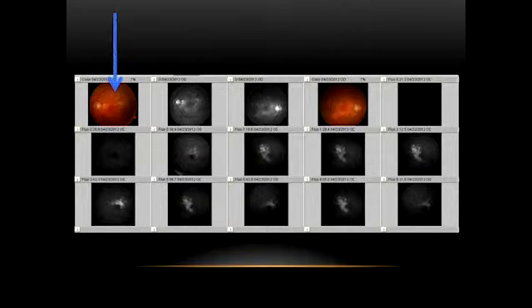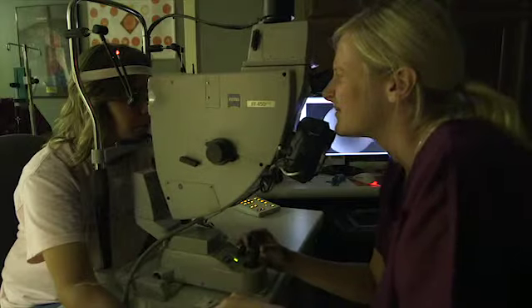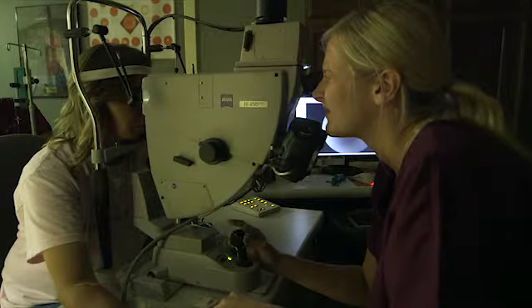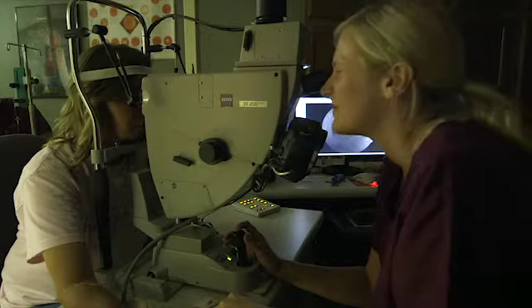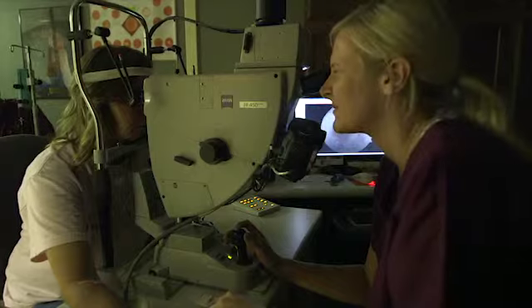Well, part of every fluorescein study is basic color fundus photography. Now, I should mention that fundus simply refers to the back of the eye. Trending macular changes with color fundus photos is very helpful, especially given the number of patients your retinal doctor sees. None of it is painful. The bright light is very bright, and I find myself blinking afterwards, but it's something that they need, and so I'm happy to go through it. It's not painful, it's just very bright.